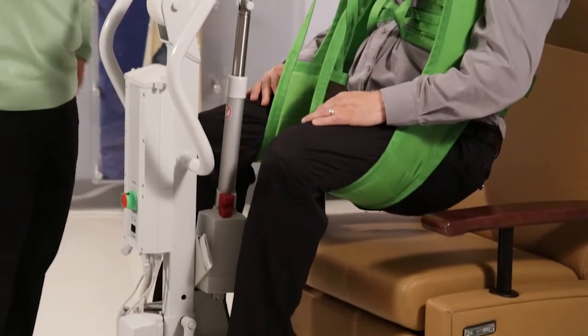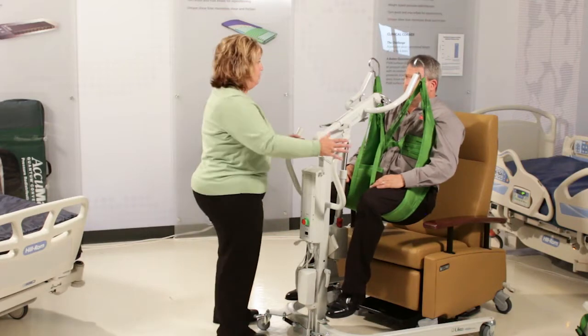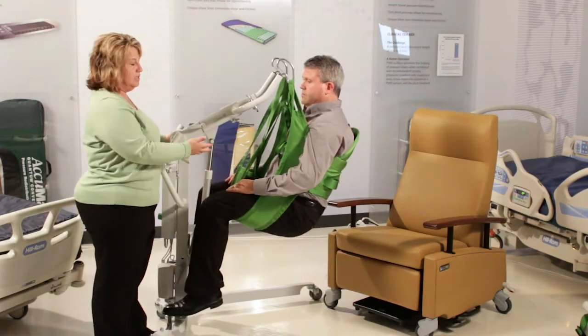Now, you cannot go from a lying-down position — it has to be just sit to sit. That is the one negative: this lift will not pick you up from the lay-down position. But you have the clearance, and we can now take you and use it as a sit to sit.